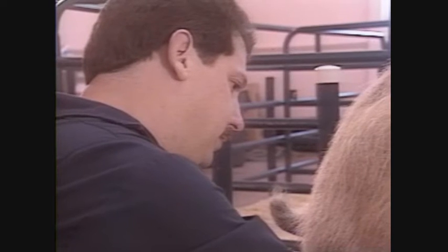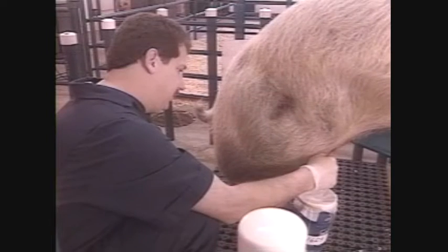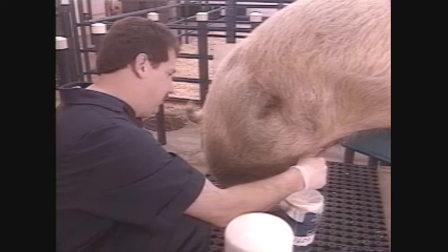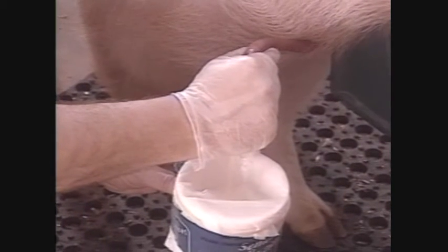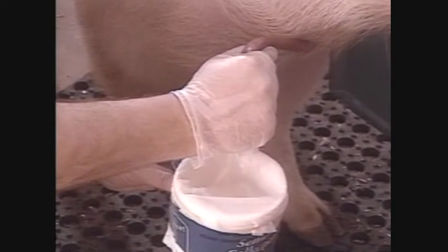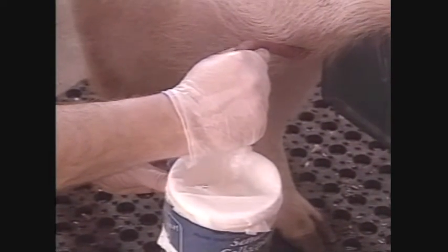Throughout semen collection, contamination of the ejaculate with preputial fluid must be avoided. This foul-smelling liquid comes from the prepuce and may trickle down the outside of the penis during collection. It is toxic to sperm. Just a small amount can kill the whole ejaculate. Some collectors wrap a tissue around the body of the penis to avoid contamination of the ejaculate with preputial fluid. Holding the end of the penis above the level of the sheath throughout the collection will achieve the same result. Careful collection techniques are most important so that the semen is in good condition when it has been collected.